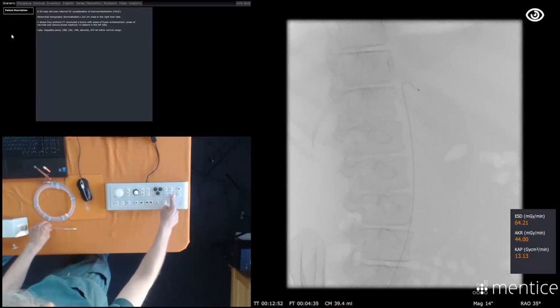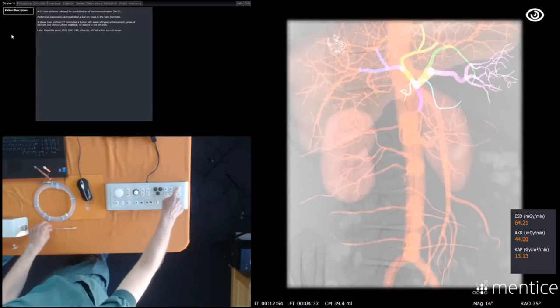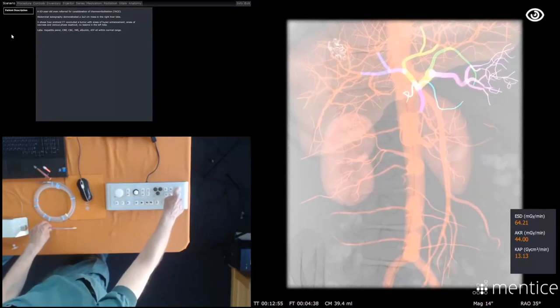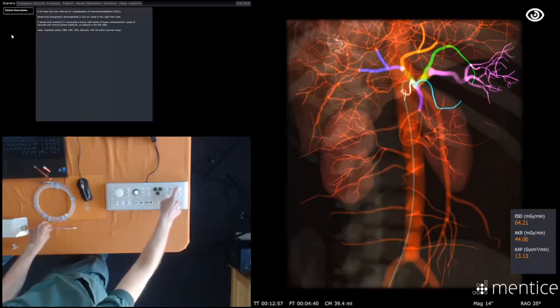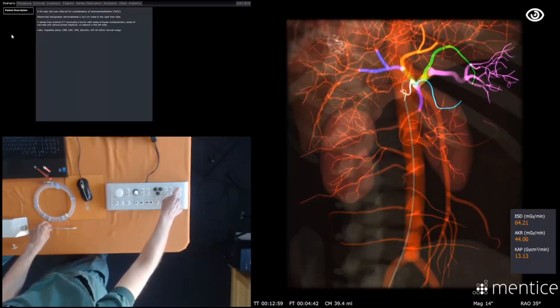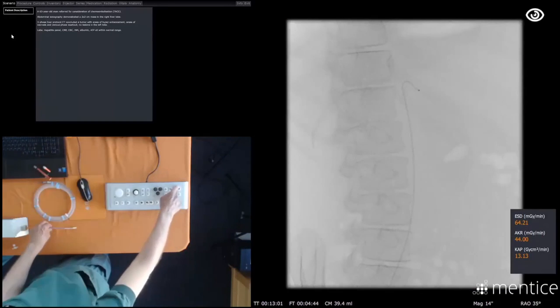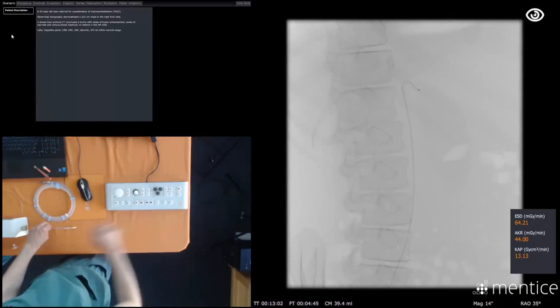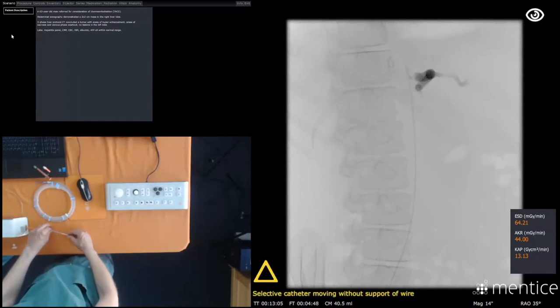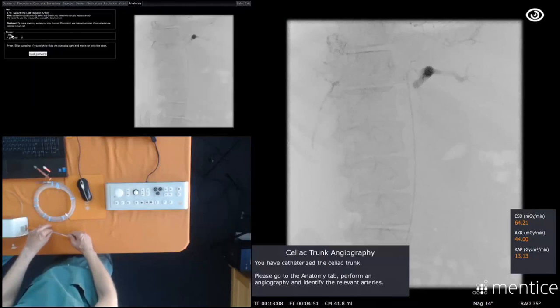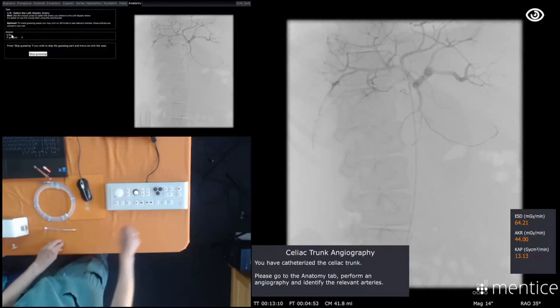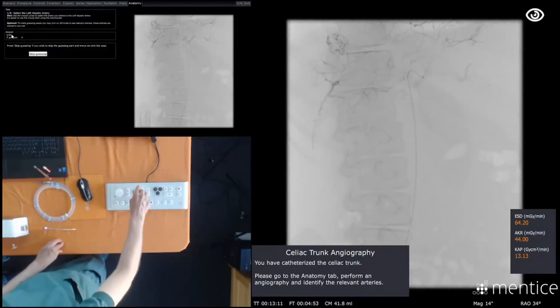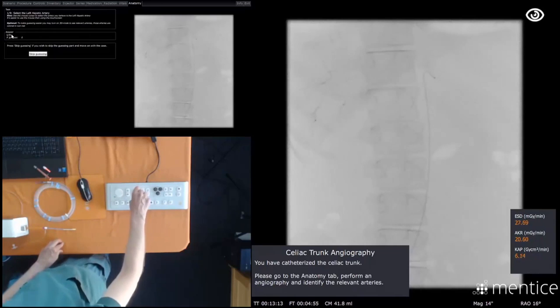If you ask me why I'm shuttling around like this, it's because the table is fixed. If the table is fixed, it gives you some cognitive function problems when you move the joysticks. All right. Can we see if we can find the celiac trunk? A feature for the beginner is also that you can actually even have a map like this. This map is quite nice. You have a lot of colors coming up here. We can come back to that later. See where we are. Oh, you are. That's a tricky one, yeah? We go into the AP position.